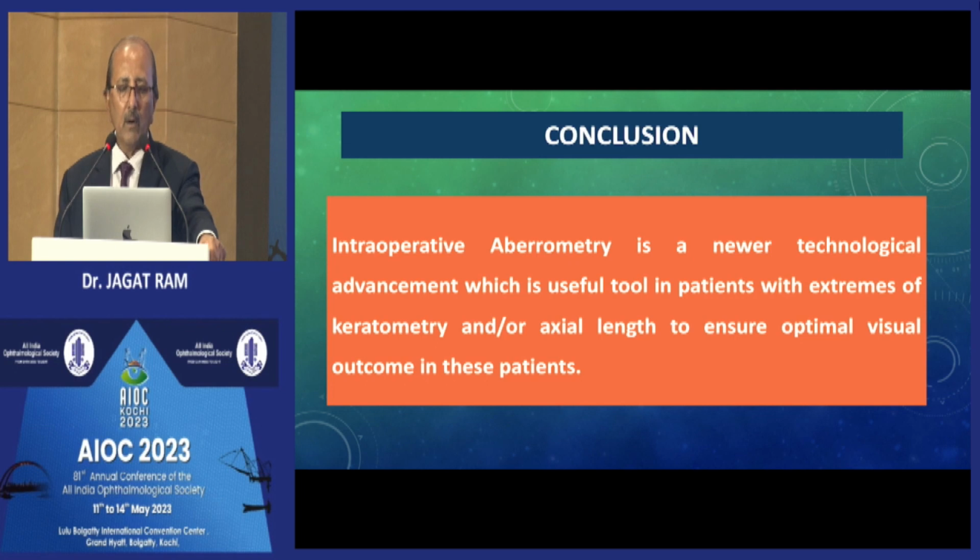So in conclusion, intraoperative aberrometry is a newer technological advancement which is a useful tool in patients with extremes of keratometry or many of the post-operative situations. Thank you very much.